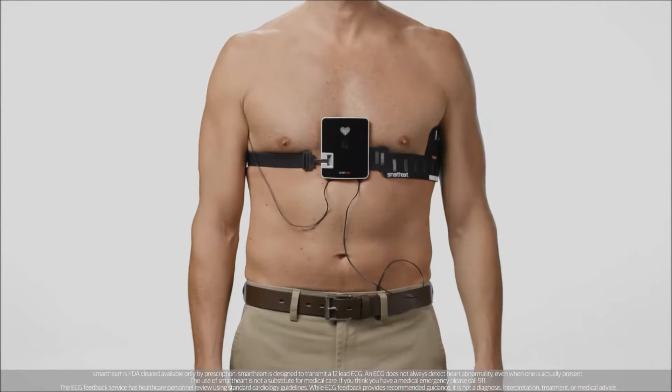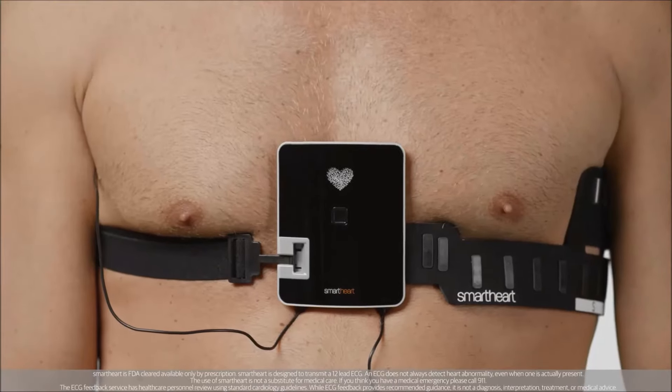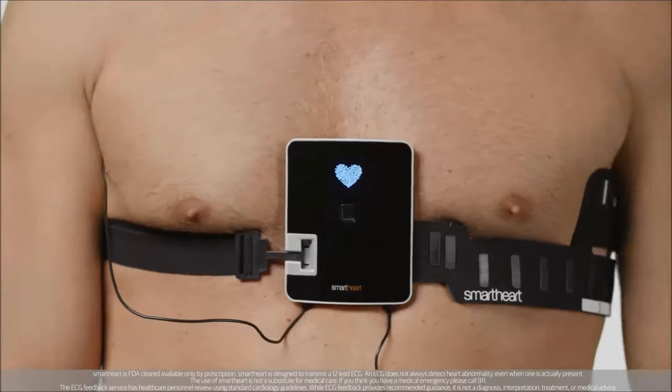With the belt in place, you're ready to start transmitting your ECG. First, make sure the Bluetooth is set to on on your smartphone. Turn the SmartHeart device on by holding down the on button until the heart-shaped icon lights up.